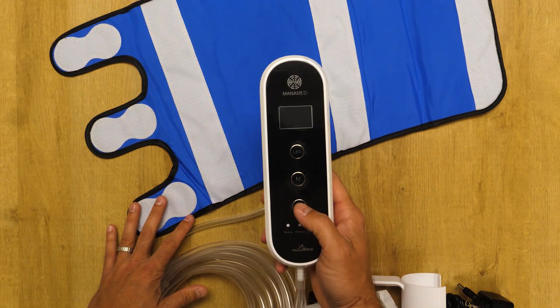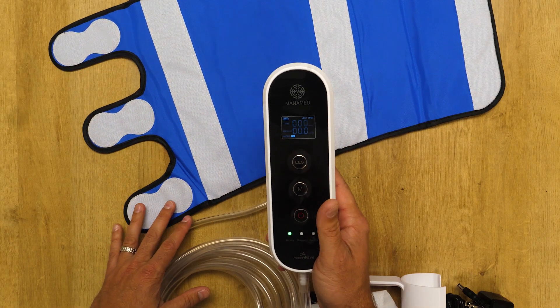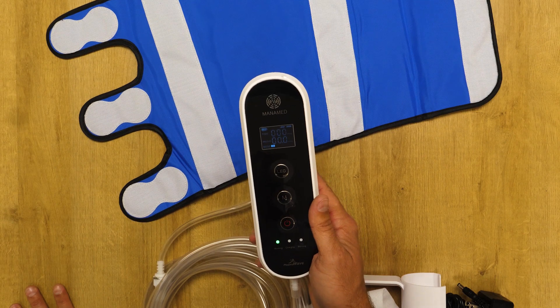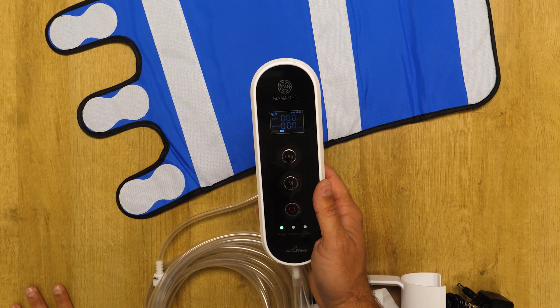To power on the unit, you would push and hold the power button. It will inflate one of the tubes and then the second tube, and then automatically detect whether it's a single leg operation or a two-leg operation.